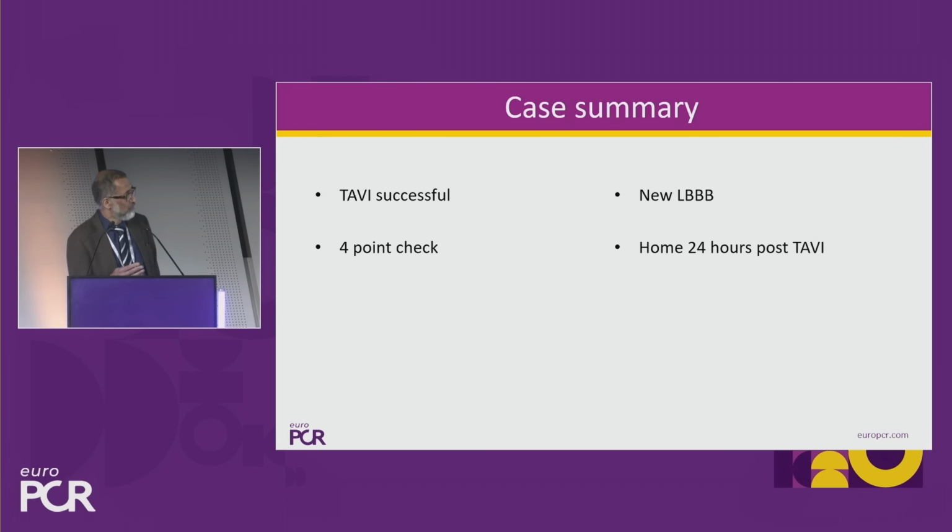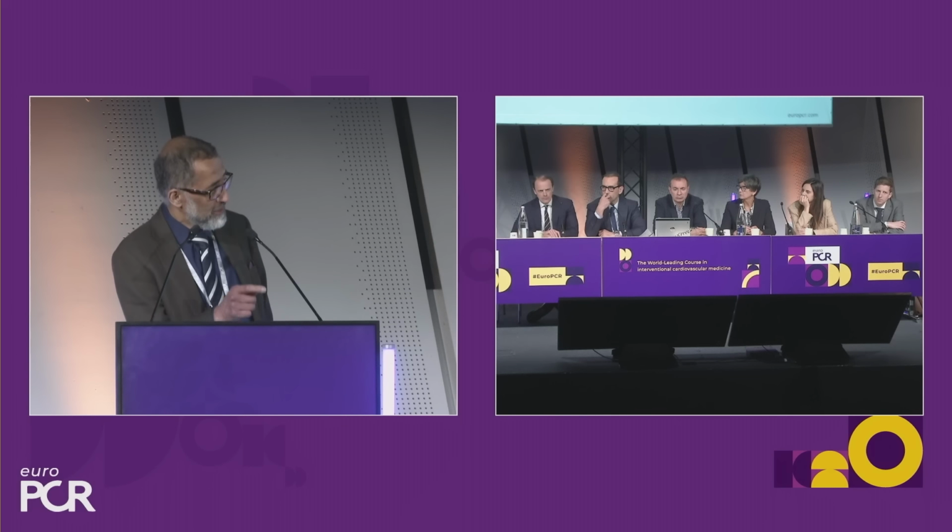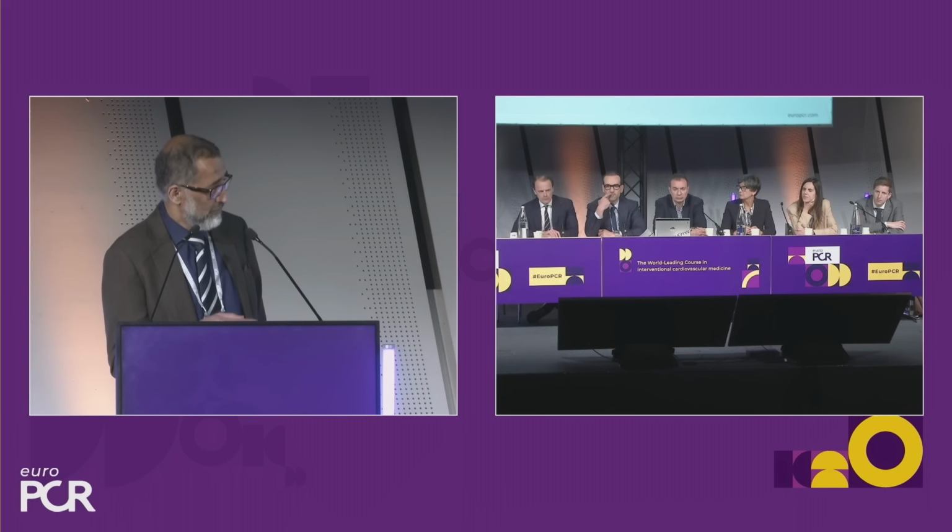So let's imagine that all of those were successful. The ECG is back to baseline, the echo's fine, the leg's fine. Our mobilization protocol is they leave the lab at 30 degrees. 1 hour later, they're sitting up in bed at 80 degrees. 1 hour later, they're sitting in a chair next to the bed. 1 hour after that, they're walking around off the monitor to make sure they can mobilize.